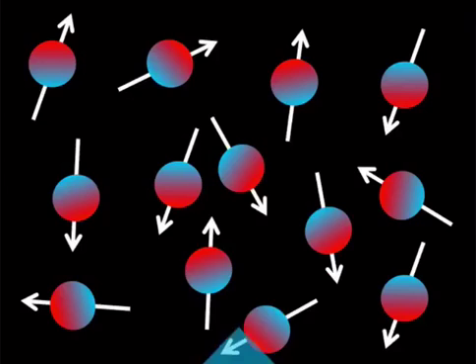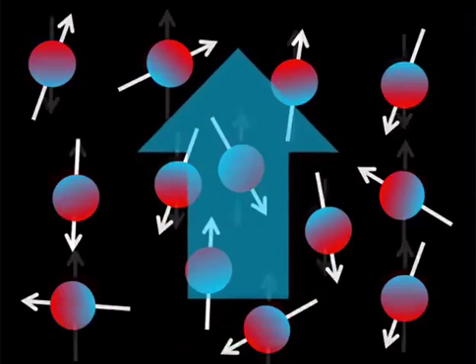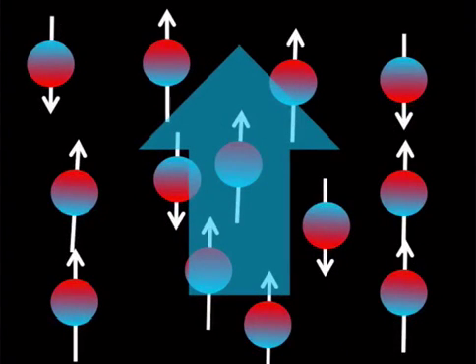Then when you apply a magnetic field, you're going to have a certain percentage of them line up with the field. This magnetic field is going to be referred to as B0 in all your MRI textbooks and MRI lectures, and in the multiple choice questions that would be asking MRI questions. But let's not get it twisted. The magnetic field is not ripping your hydrogen atoms around your body. The hydrogen nuclei themselves don't move. It's the magnetic moment that aligns.